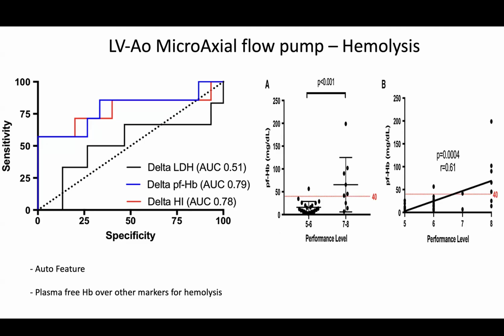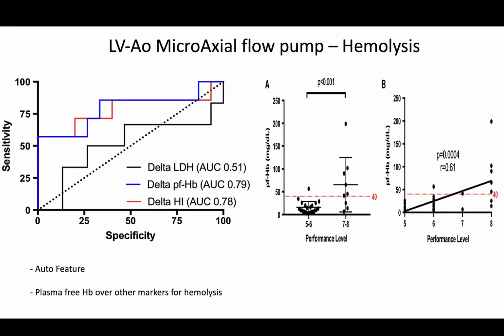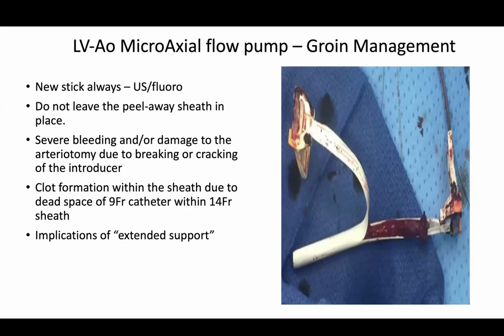And so if you see me using these devices, I rarely go above P6, based on, not human data, but I think it's helpful. And honestly, the difference between P6 and P9 in terms of support is not that much. And if you need it, you probably need to upgrade to a higher level of support.